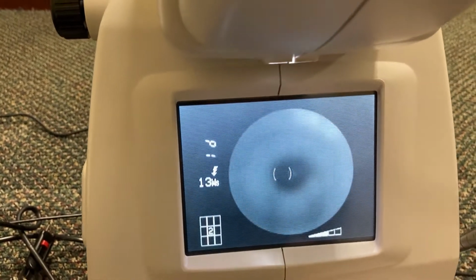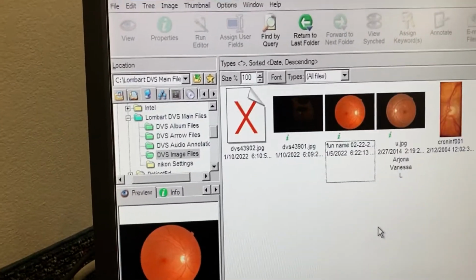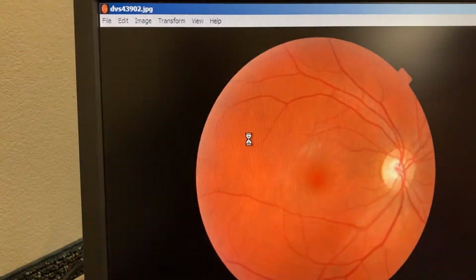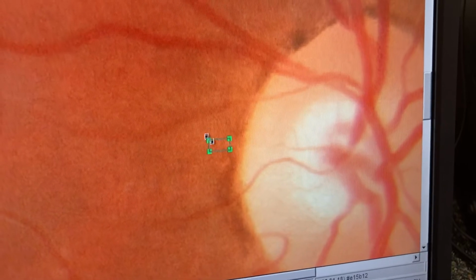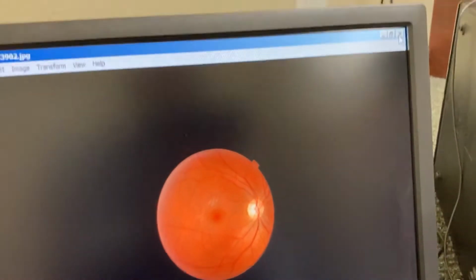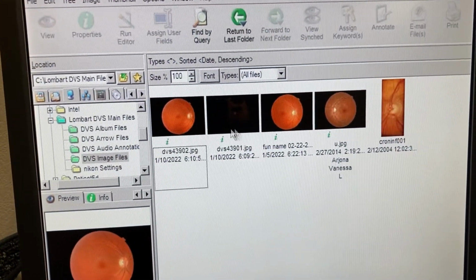That's it. We pull back, and it's thinking. There's our picture, pops up. Yeah, that's it. And you can zoom in. I'm doing this with the mouse roller just to zoom in, and that's really in focus. There we go. Little roll bars. Yeah, and you can zoom back out. You can close the image, and you are back to still having all the images.